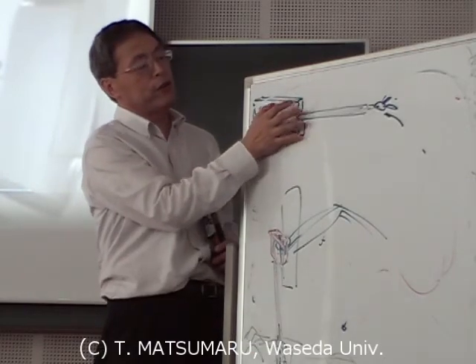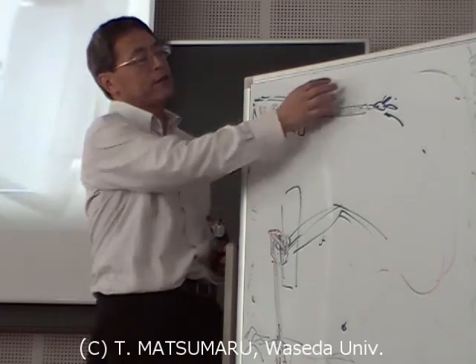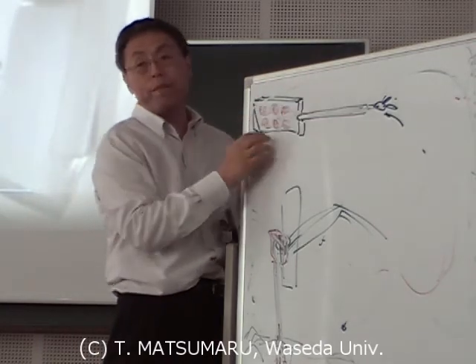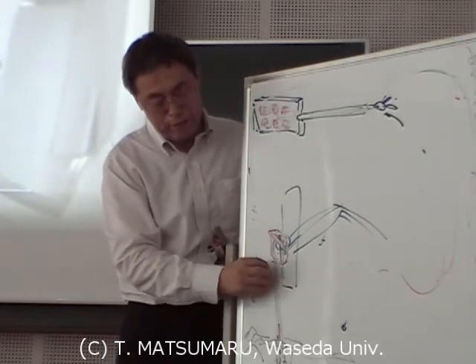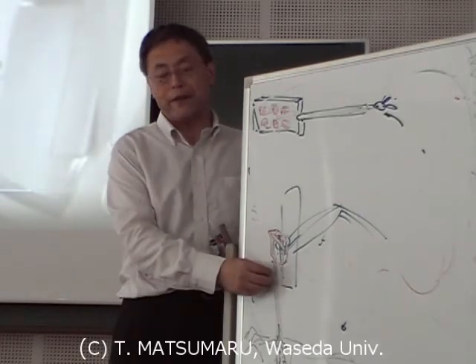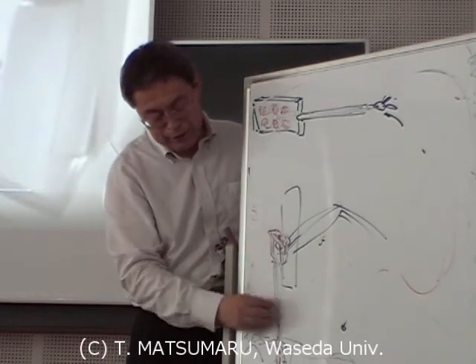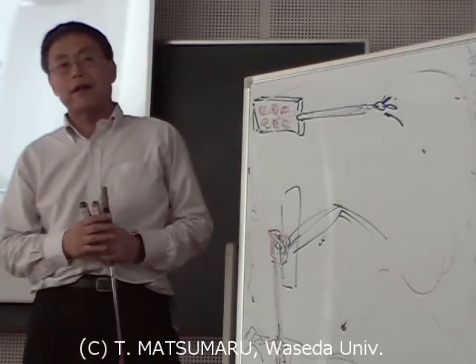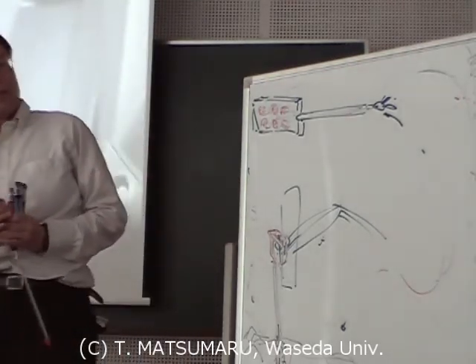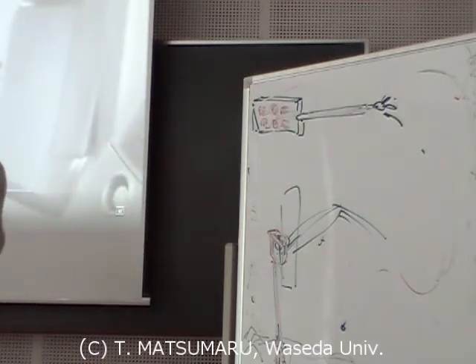If we want to use this part on another patient, we have to sterilize it first. So this part should be released and attached again. The robot arm is the same, but this part is used again and again. So it must be easy to kill the virus. Therefore, the attachment system is used.